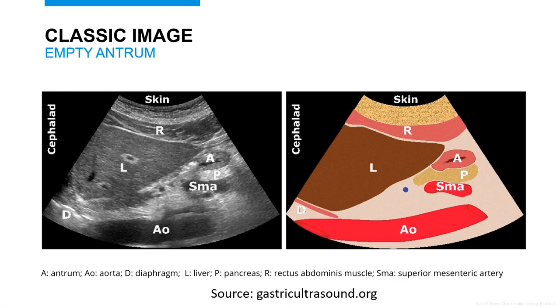We know we are at the antrum when we see the stomach, the pancreas, the SMA, and the aorta all in the same image. You may have to slide your probe parasagittally to get the alignment of these structures in the same frame. It is imperative that you prevent having an oblique cut of the antrum by keeping your probe perpendicular to the surface of the skin.